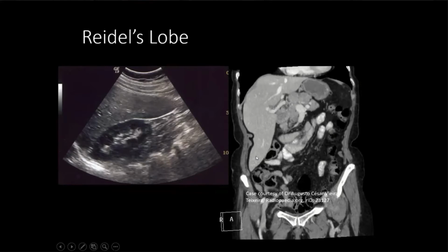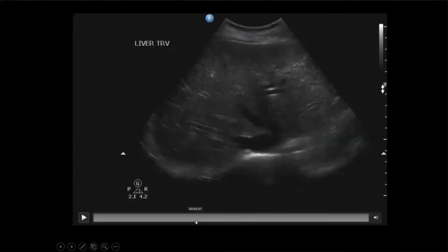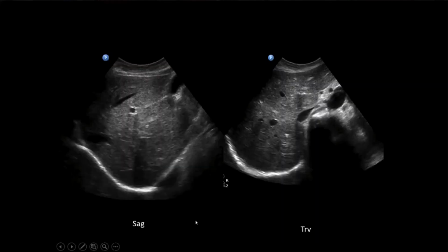All right, so once again, we have our nice normal liver. And then what about this one? Compare it to this view. What do you notice about that one? I'll kind of video through here.